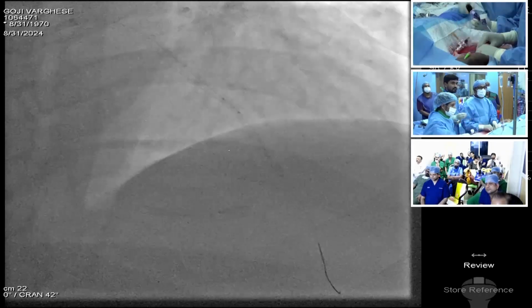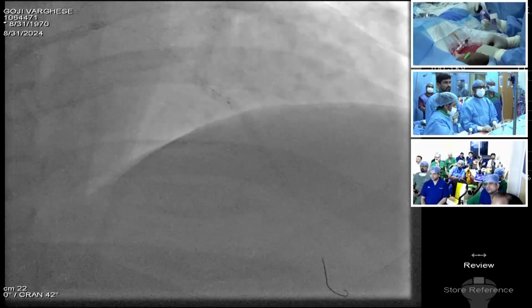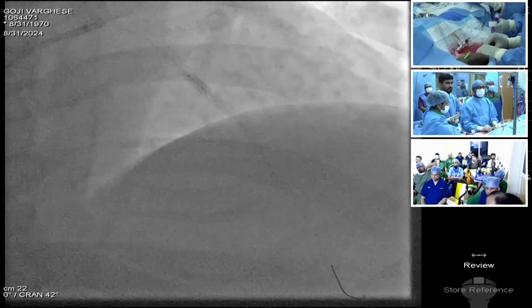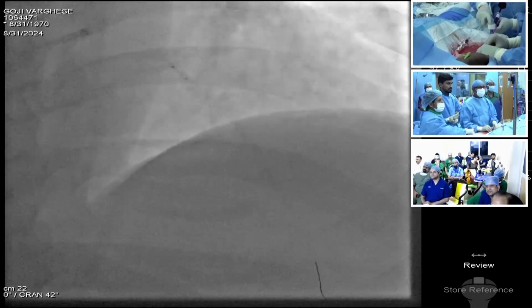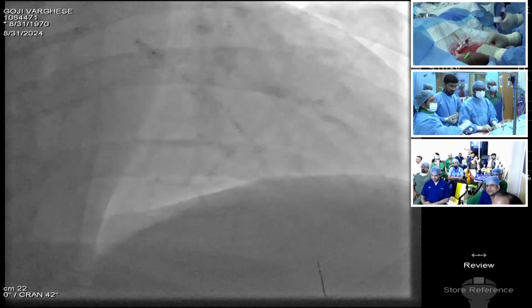Okay, 10, negative. 12, negative. 14, 16, negative. 18, negative. 18, 20, negative. 20, negative. 20, negative. 22, negative. 22, negative. OCT catheter.